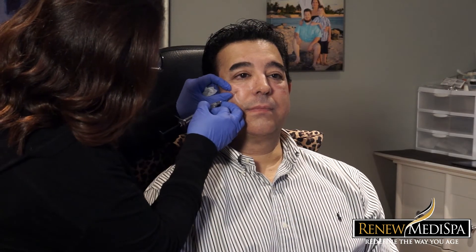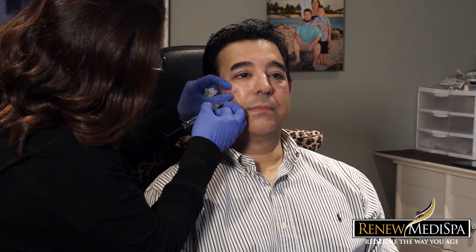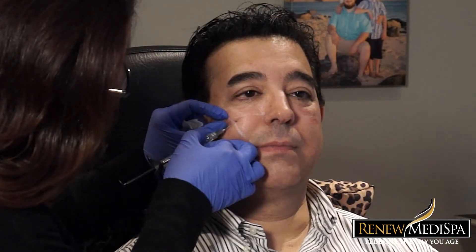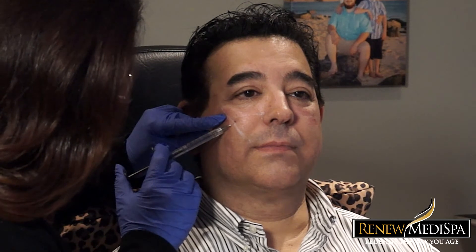The micro cannula minimizes trauma, minimizes pain, and minimizes the likelihood of bruising — although that's not a hundred percent guaranteed. It also makes healing very easy. Instead of making multiple needle pricks in a very sensitive area, we're able to go in primarily with the micro cannula under the skin and deliver the product precisely where we want it without disrupting the skin barrier more than necessary. Sometimes on the outside of the eye we revert to the straight needle technique, but overall the goal is to create a procedure with zero downtime.